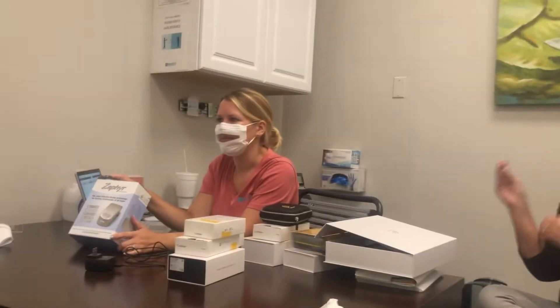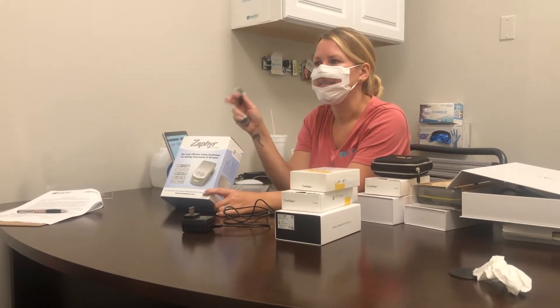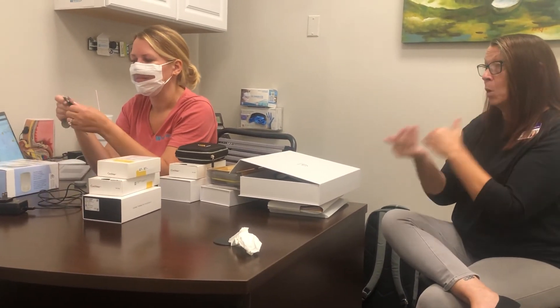At night you will take the processor and the battery off your head and place it in this box — this is the dryer. The battery does go in the dryer; it all goes in there together. This will dry out the processor and the battery.